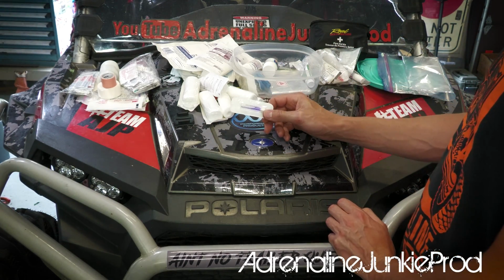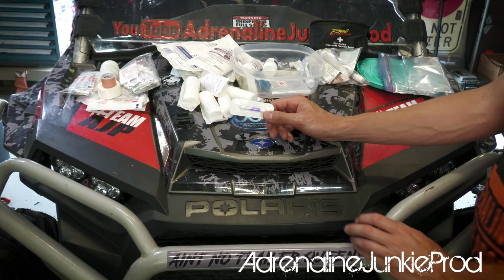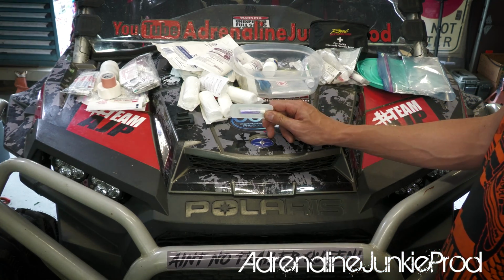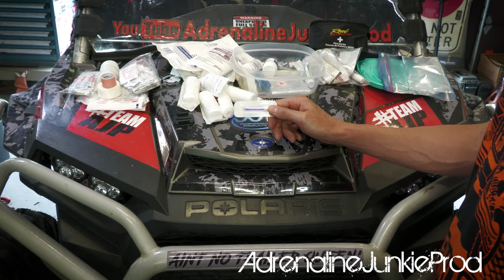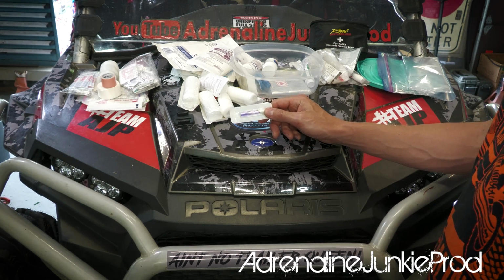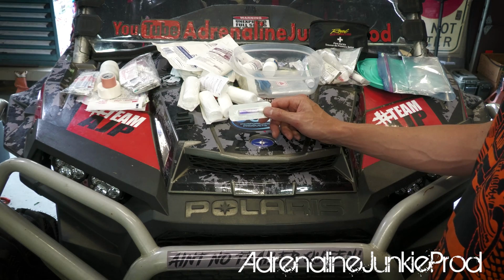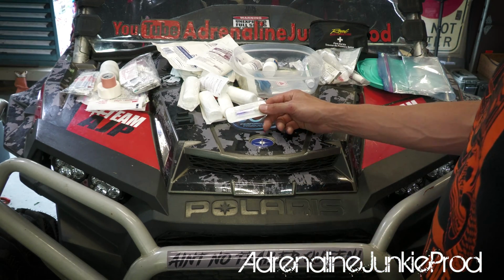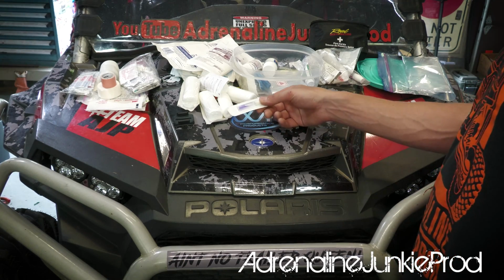Dermabond, wicked stuff. If you want to be cheap and cut corners, get yourself some super glue. Dermabond is essentially a medical grade, high viscosity super glue made for skin. It's a glue stitch, basically. We use this in the ER for stuff that's hard to stitch or for a quick fix.